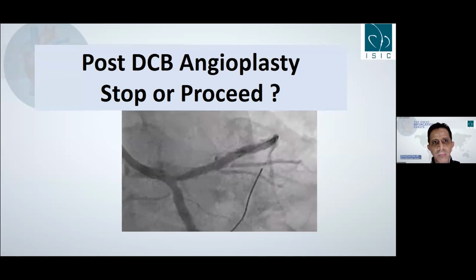Okay, thank you, Dr. Fauzi. I think it's a very nice case, and it looks like there is some stenosis still there in the proximal. Did you do a functional test or something? No, we did not perform functional tests. Yeah, I think we have to invite Dr. Goran, Professor Stankovic. Do you have any comment regarding that?